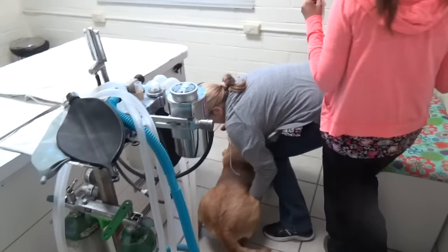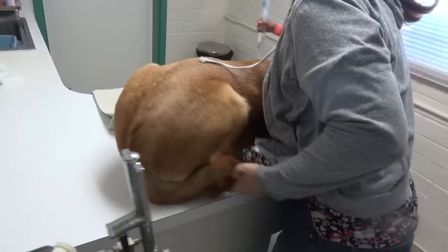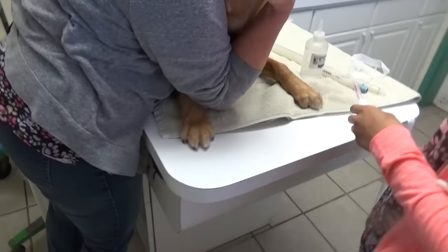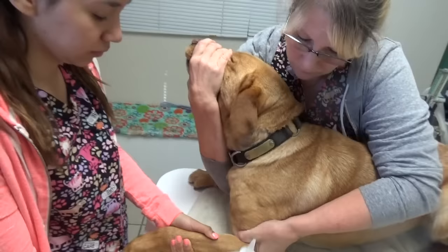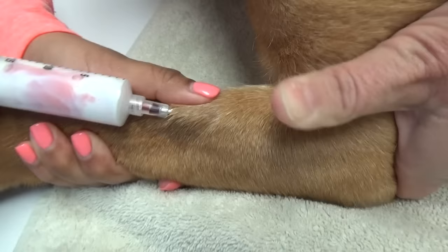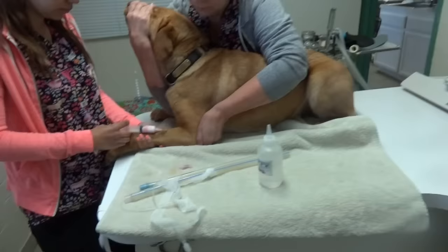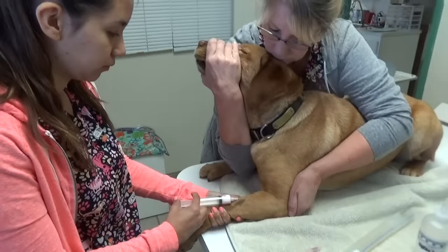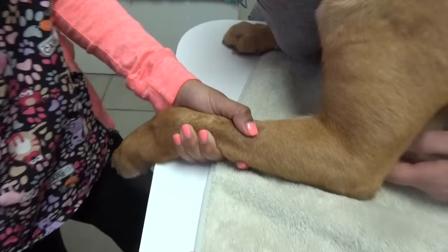What do you think? So a lot of times it's hard to lift animals on the table, because we have to lift them on the table so we have a good working area and a level at which we could do all our work. So Bear's had the pre-medication, and now we're going to give Bear the anesthetic. So here's the propofol. Look how white it is. It's like milk. It goes right in the vein slowly. And then we'll put the trachea tube in so that we can keep the gas going in to Bear during the surgery. We use the IV anesthetic to start the anesthesia. And we use the trachea tube to continue the gas anesthesia.